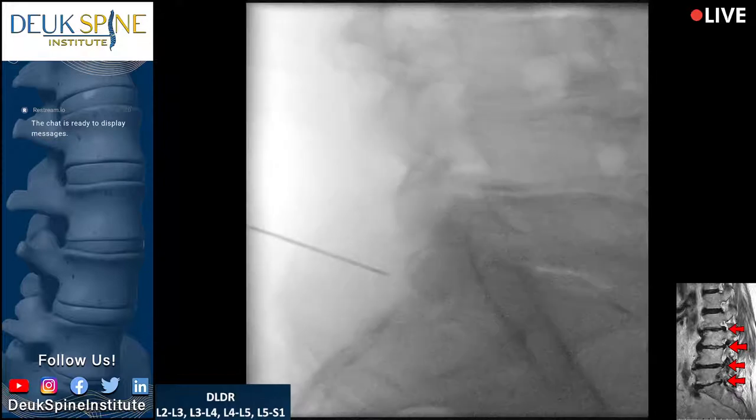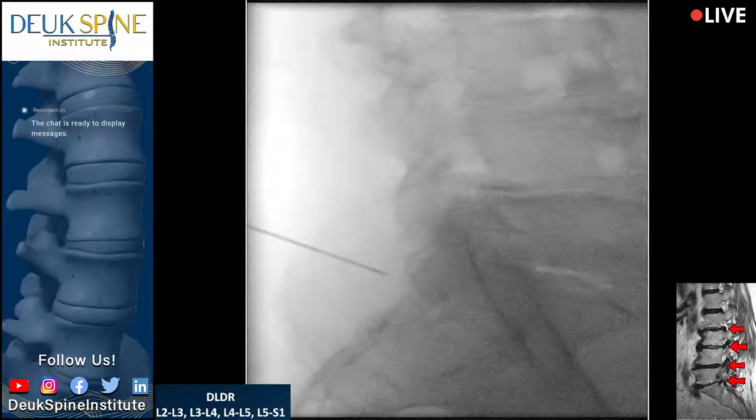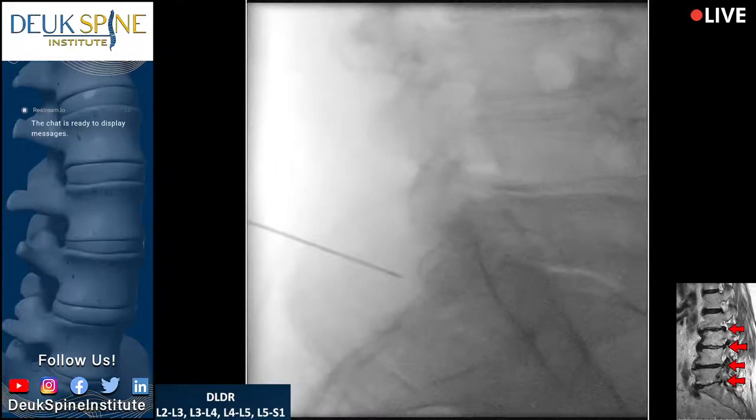All right, so why are we struggling with the X-ray? The reason why is that the normal anatomy is gone. He has such severe arthritis from his discs and facet joints that it's distorted the normal anatomy. And we need normal anatomy like the neuroforamen, the end plate, this facet joint. We need to see that to be able to navigate correctly.